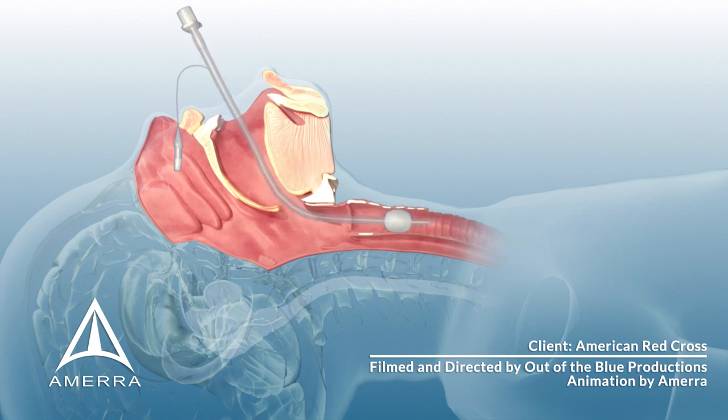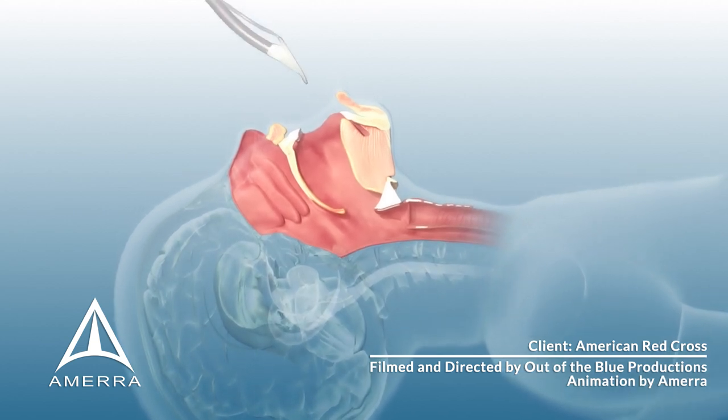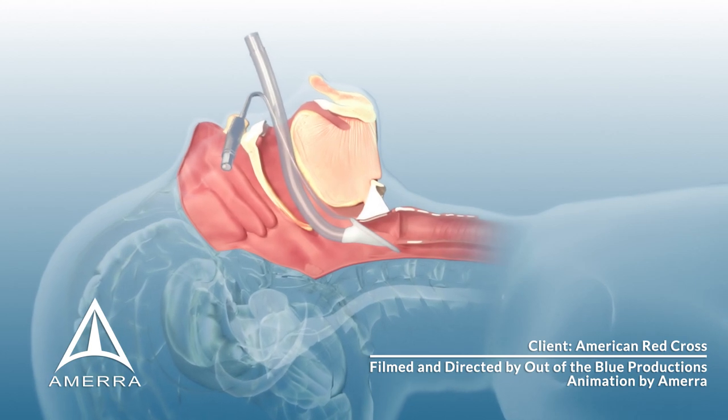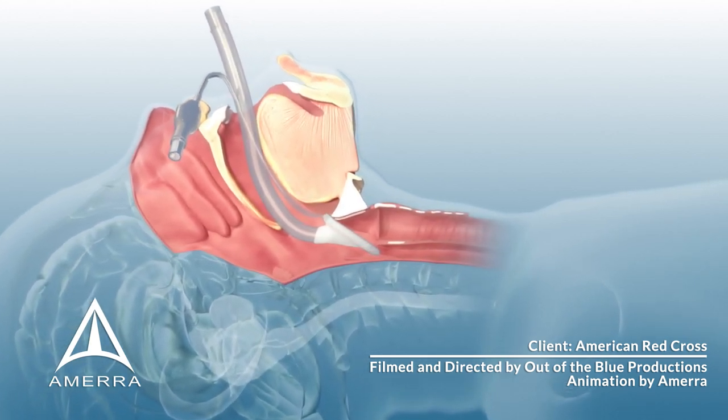Supraglottic airways, such as the laryngeal mask airway, are inserted through the patient's mouth with the opening of the mask facing the patient's tongue. The mask is advanced along the contour of the pharynx until resistance is met. When properly positioned, the mask opening overlies the glottis while the bottom rim wedges against the upper esophageal sphincter, creating a seal. Inflating the cuff of the mask isolates the glottis, permitting air to enter the trachea.